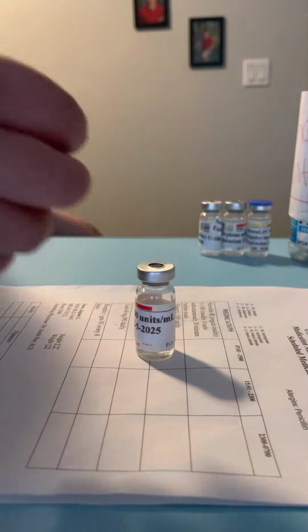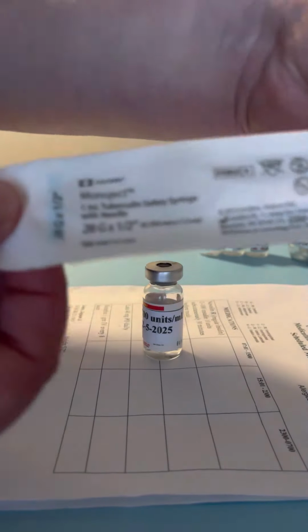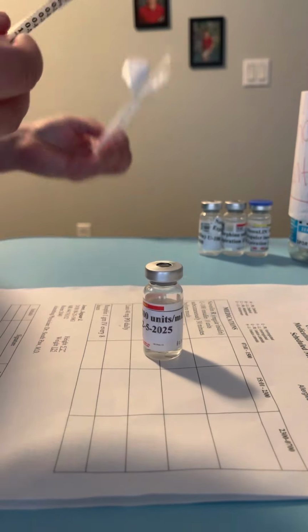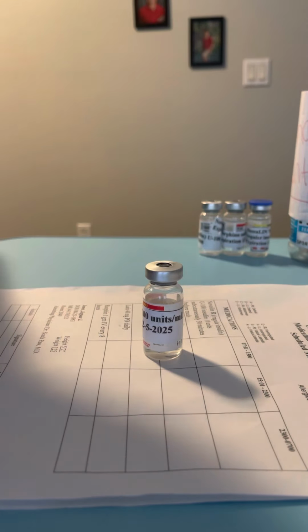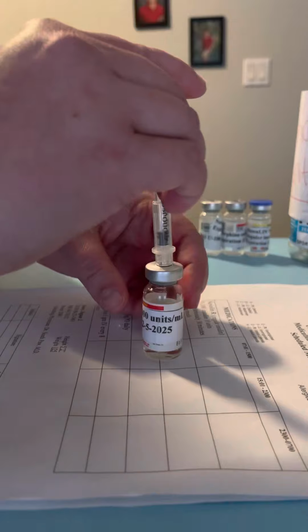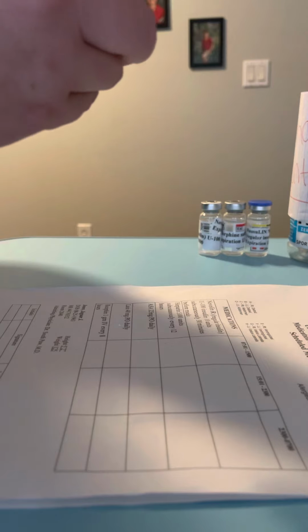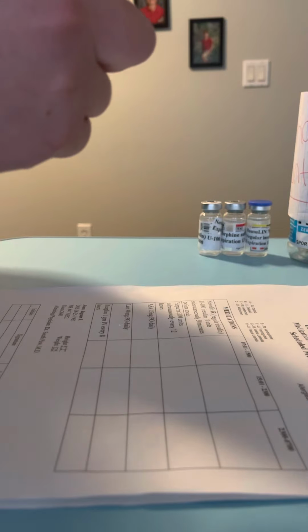Okay, so I'm gonna get my alcohol swab. I'm gonna clean the top. Get my syringe. I have a 1 milliliter tuberculin syringe. Remove the cap. I'm going to draw back 0.5 milliliters of air. Inject it into the vial. Flip it over. Draw back 0.5 or a little bit more so I can make sure to get out any bubbles.